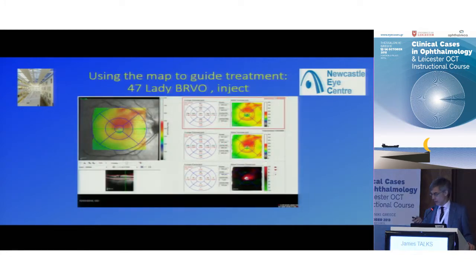So the decision, often the initial decision is, is it a vein occlusion? But basically, is there intraretinal fluid? Is there fluid you're going to treat? How are you going to treat it? Mostly it's injections, unless it really isn't involving the center, and then you might still consider some grid laser for a BRVO. But then how do you monitor it?